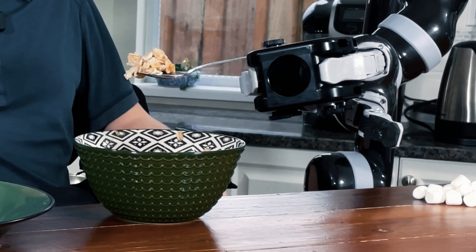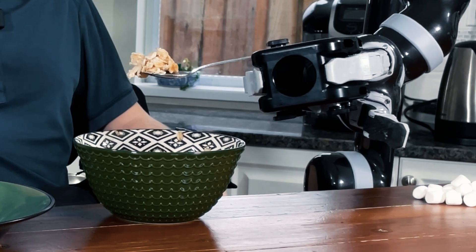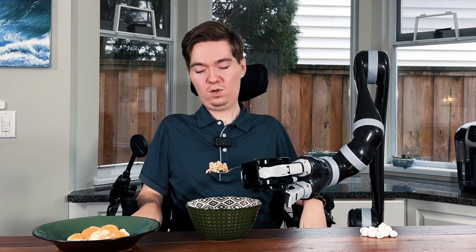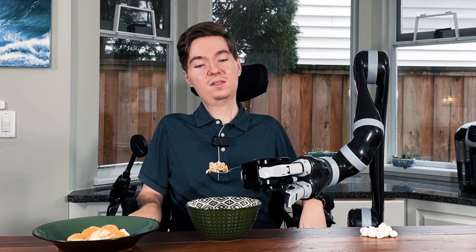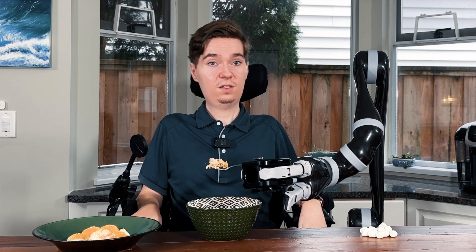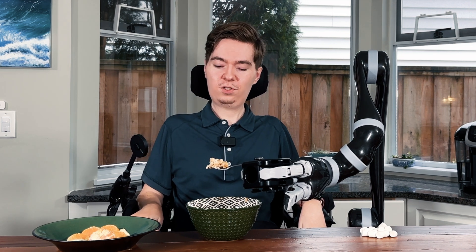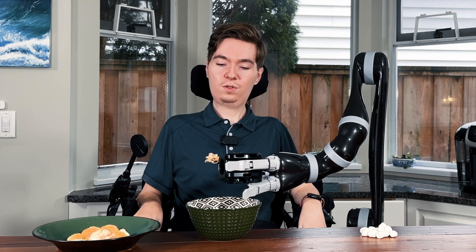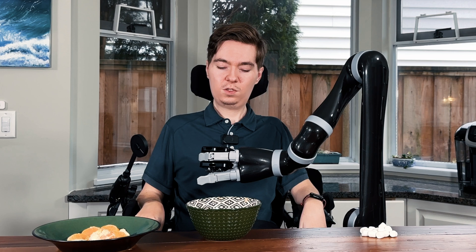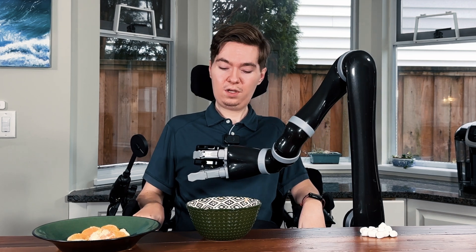We've got a nice spoonful of food — maybe it's a bit overfull, but we're going to do our best to not make a mess. Ideally, you want to make sure the spoon is level for the transfer so that it's not tilting and falling off onto your lap, which is important. I'm just going to begin moving Jayco as normal — nothing special about how I'm moving Jayco now — I'm just being conscious of the orientation of the spoon.